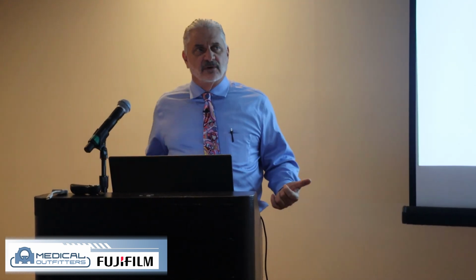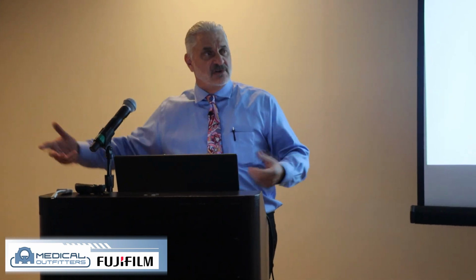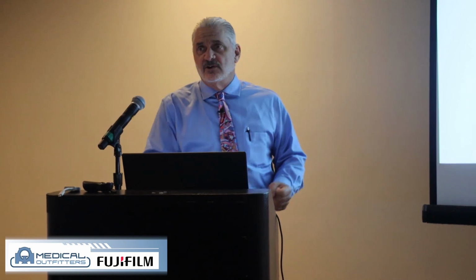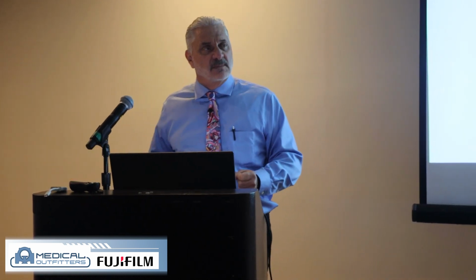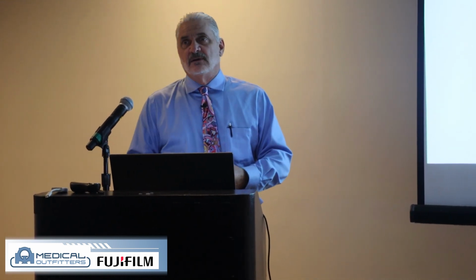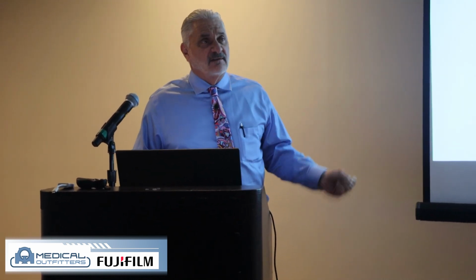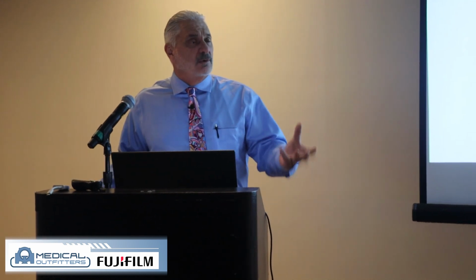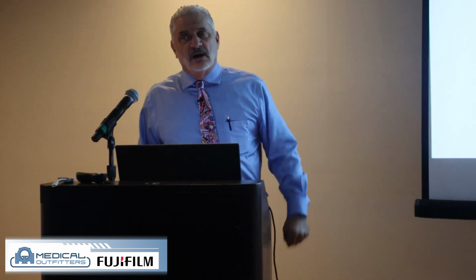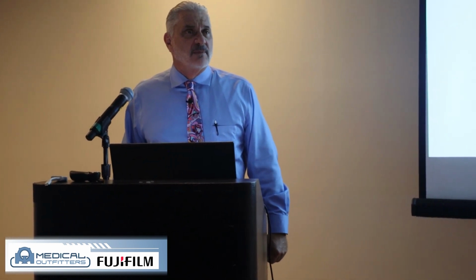They could actually reverse this, and cardiologists use this to help try to get the patients back on the right track. If not, then you're just entering them into the system to have the next set of tests or battery of tests. And if you have a fast enough CT scanner, such as a 128-slice scanner, then you're able to go in and do the angiogram part from there.